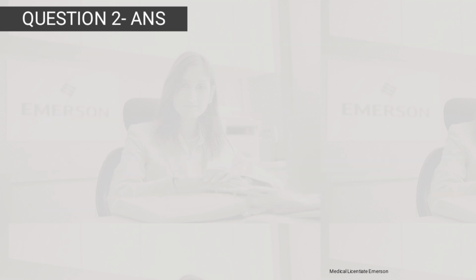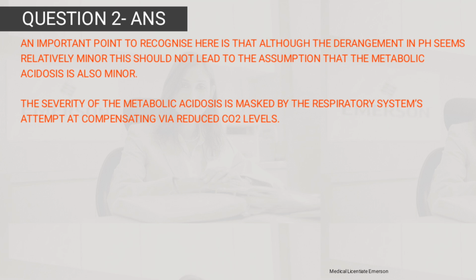An important point to recognize here is that although the derangement in pH seems relatively minor, this should not lead to the assumption that the metabolic acidosis is also minor. The severity of the metabolic acidosis is masked by the respiratory system's attempt at compensating via the reduced carbon dioxide.